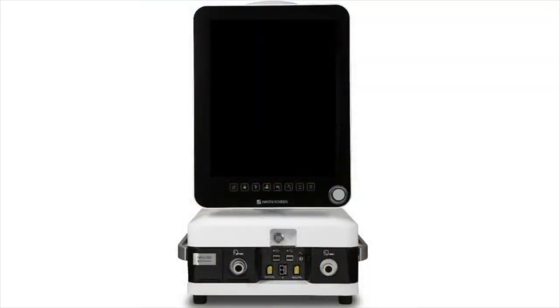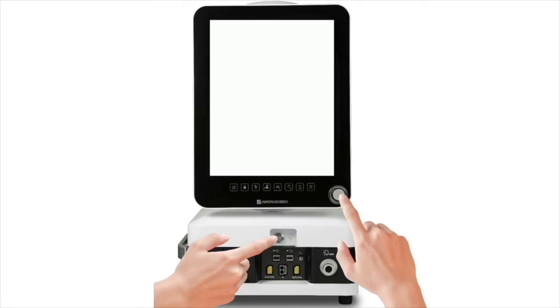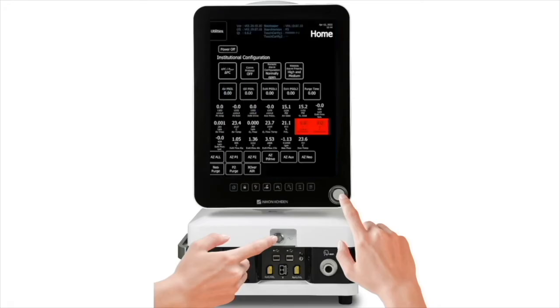To access the service menu, the ventilator needs to be off. And before powering on, you need to press the encoder knob in and push the power button at the same time. After the ventilator powers on, you can release the power button, however, keep the encoder button pushed in. Be patient. Even though the machine powers on, you still need to press in on the encoder knob until you get to the service menu. Once in the service menu, you can take your finger off the encoder knob.